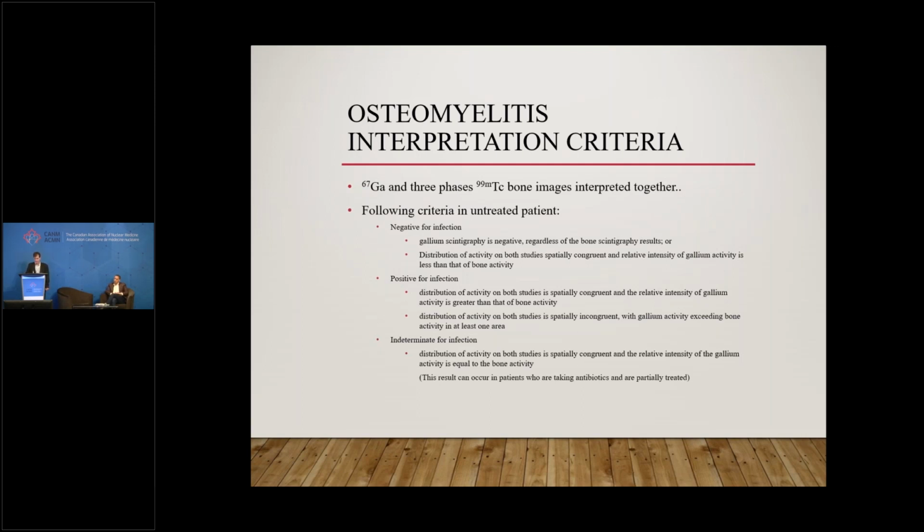So if the gallium scintigraphy is negative, regardless of the bone scan result, it is negative. And the other criteria is that if the distribution of activity of the bone scan and the gallium is geographically congruent, with the bone scan being more intense than the gallium, this is considered to be negative for osteomyelitis.